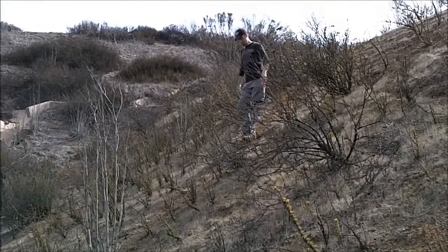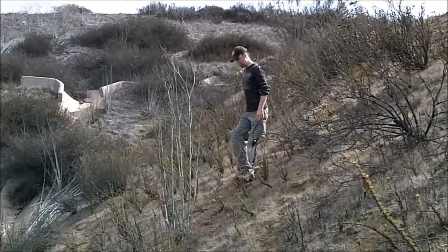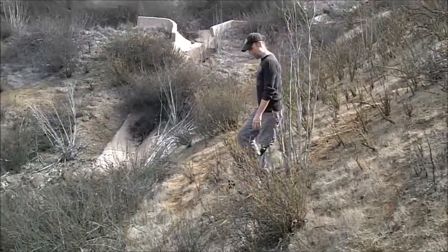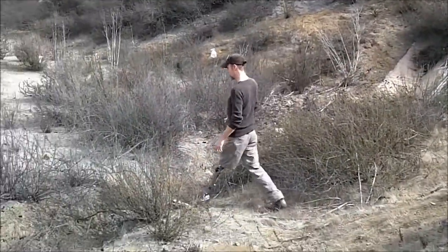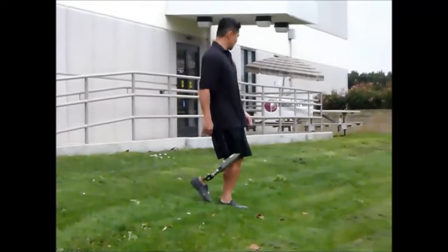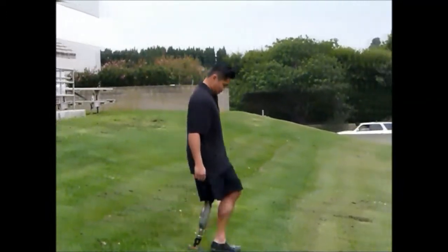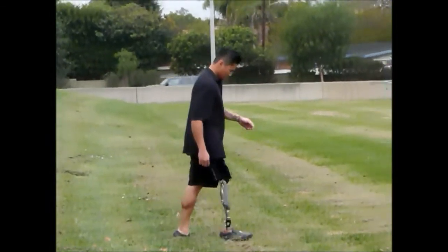Now, what you need when you're trying to walk downhill, you have a certain angle that no matter what happens, the patient is never going to go into a swing mode. So if it's greater than 20 degrees, the odds are he's not ever going to trigger into swing. Because in order to trigger into swing, you need multiple issues going on. One, you need to have the knee into full extension. Two, you need to have a load on the toe. And three, you have to initiate that flexion.